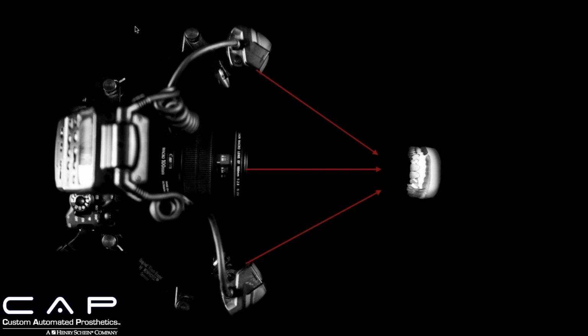And this is where the bracket for the flash comes in really handy. You can see it in the photo. It's Winfotech, made in Germany, and these you can find on eBay or PhotoMed or a lot of different places. And there's some new ones that are coming out, so keep an eye out for those.